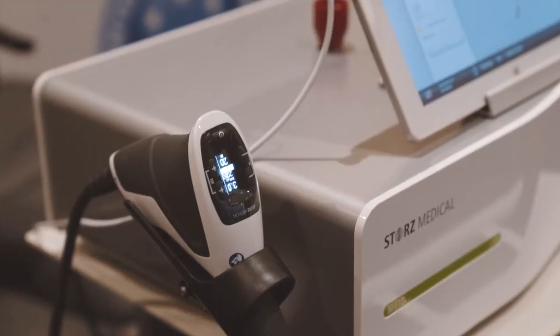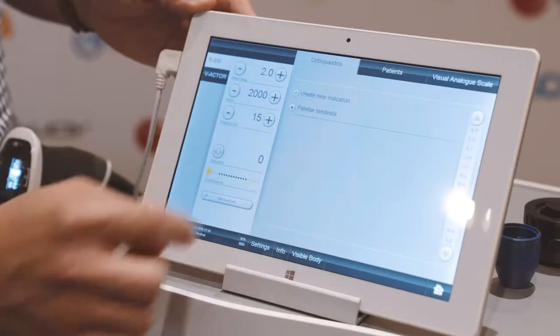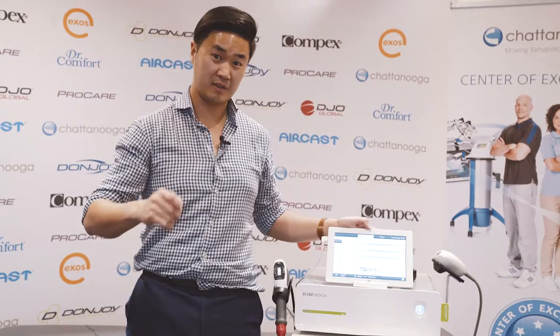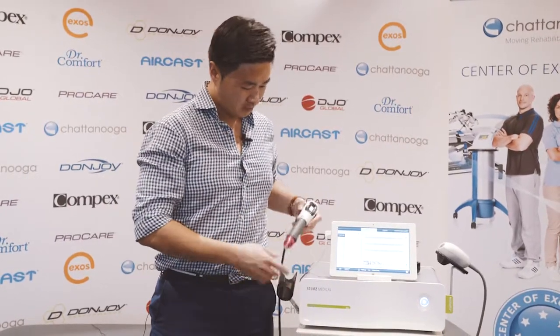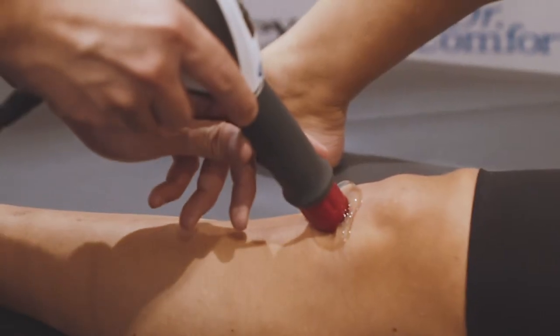The settings I like to use: I would typically start at 1.8 bars at about 15 hertz. Any higher than that can aggravate the knee — what we want is a comfortable dose of pain, not overly sore. When we turn it on and target the patellar tendon, I like to move it around instead of keeping it still.